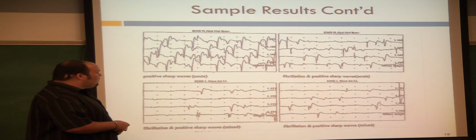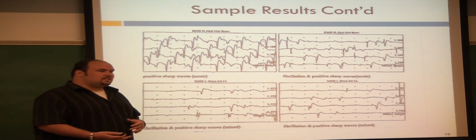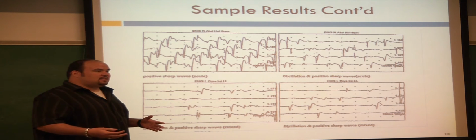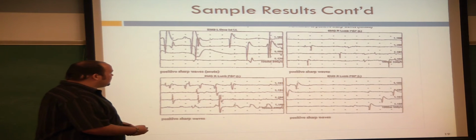foot. So that diagnosed initially that there is something wrong with the nerves, but what's nice about an EMG is that you can test a variety of places to figure out exactly where it's coming from and what type of nerve pain it is. And that's actually what they did.